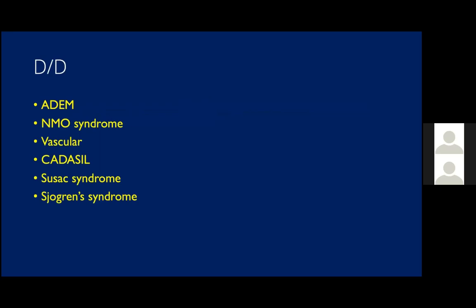And I will talk about at least these syndromes and diseases in this particular presentation, because I cannot talk about all these pathologies in this one presentation. But still we can discuss some of these diseases.